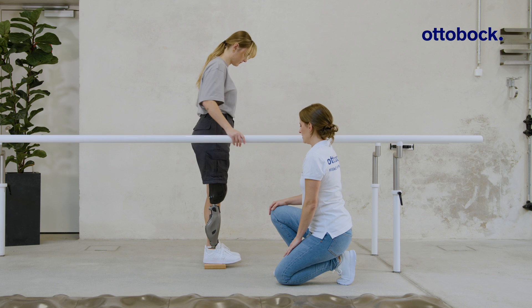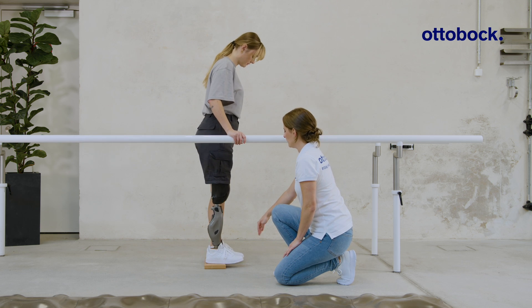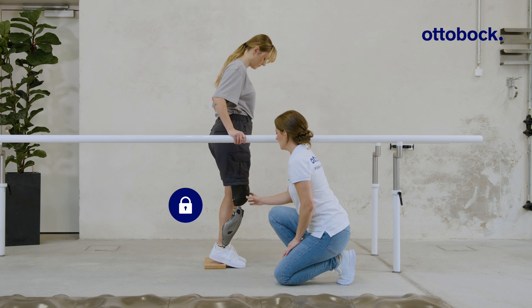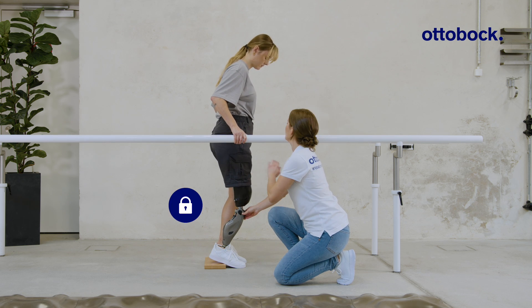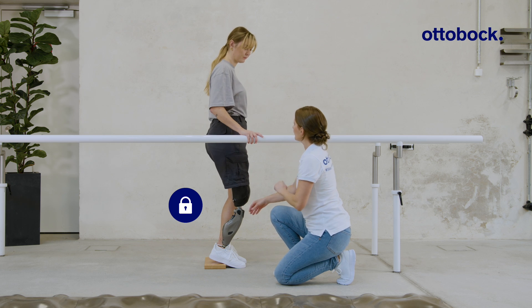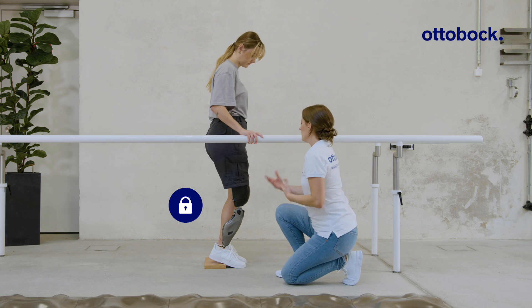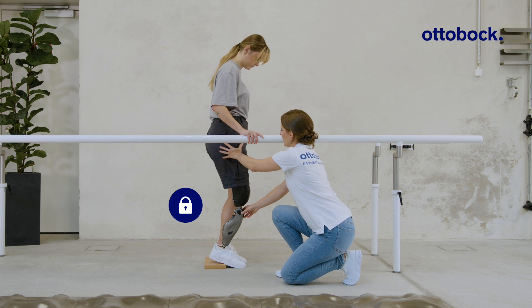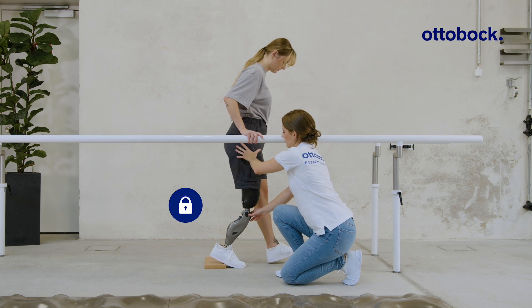Start the exercise by showing how to deactivate the stance function. Deactivation through forward rotation: step forward with the sound side and move over the flexed knee joint. The knee joint will yield with smooth stance flexion resistance. This deactivation method is only possible with an intuitive setting.